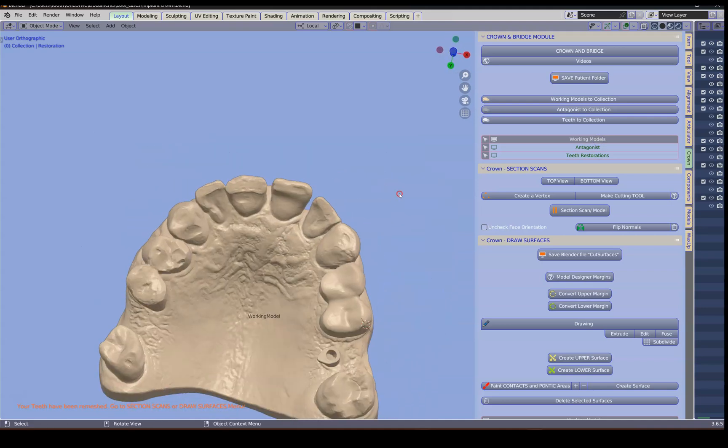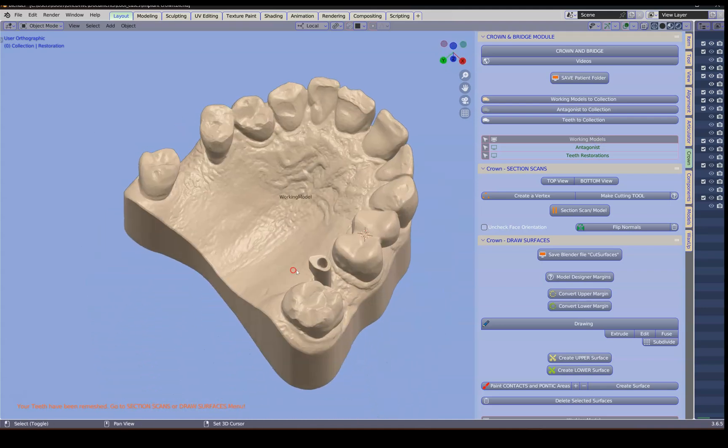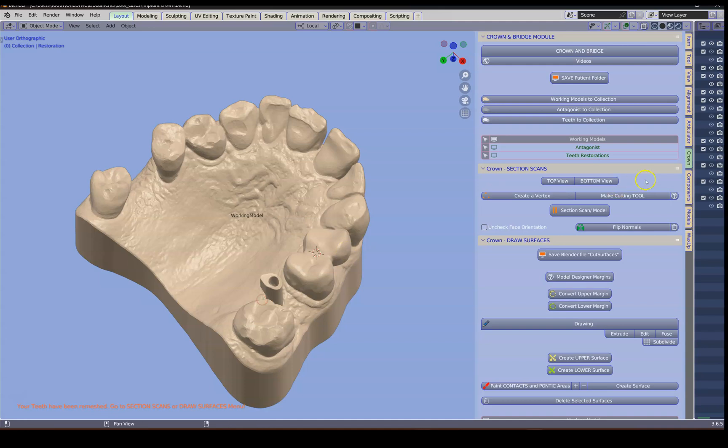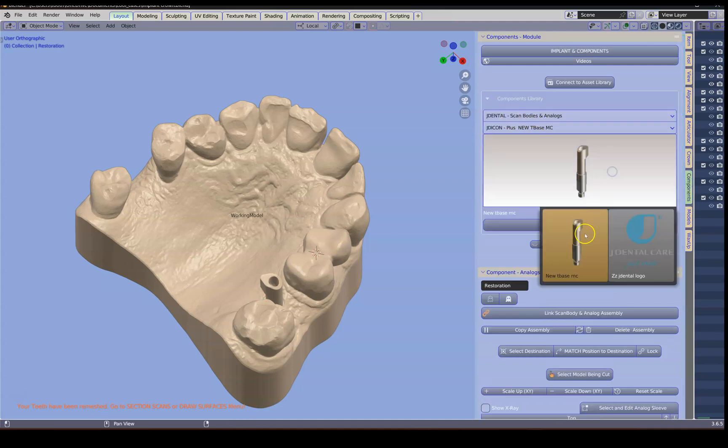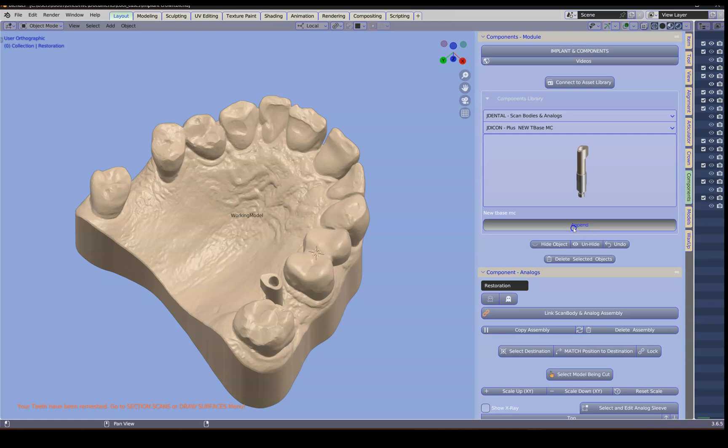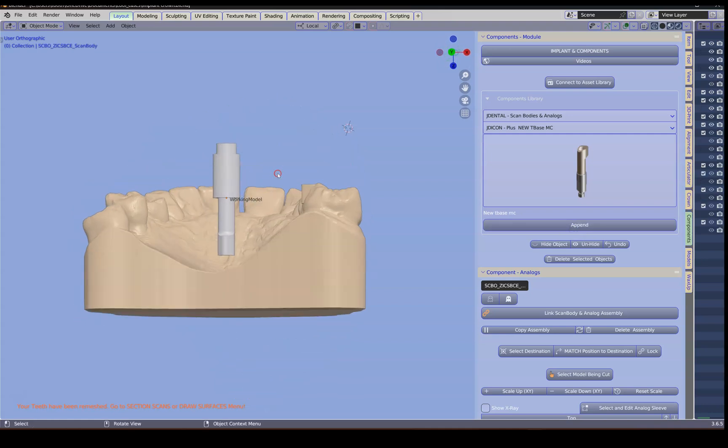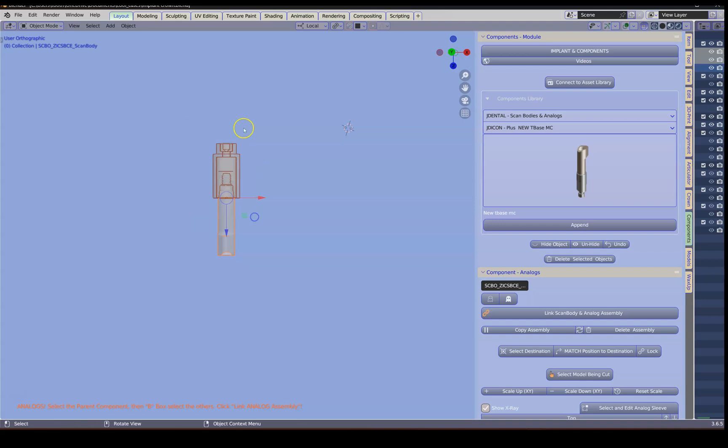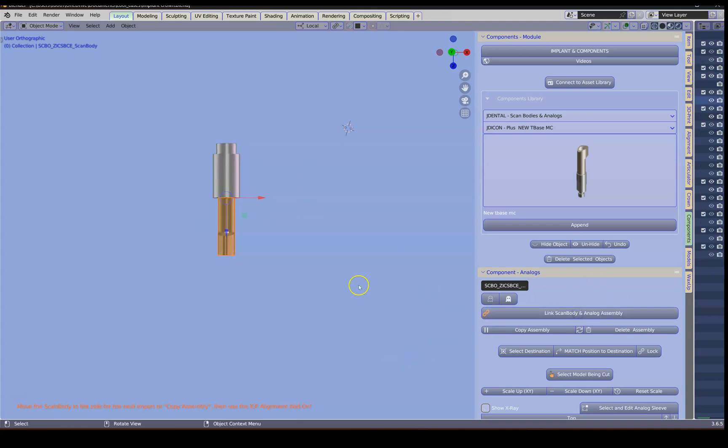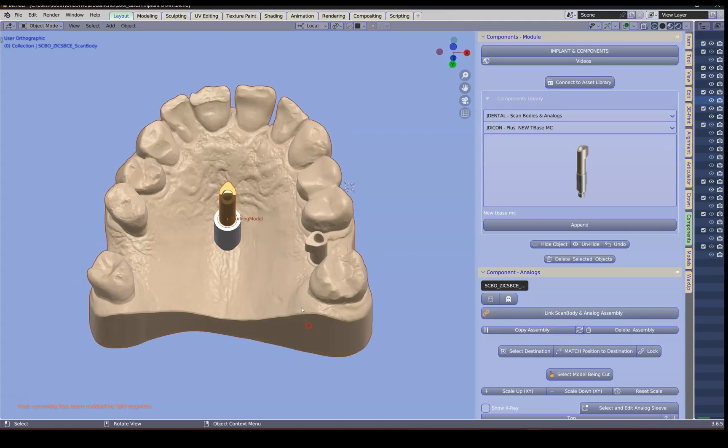Next what we want to do is we want to get a part over there. So we're going to go to the components module. This is a J Dental and we're going to select that one which comes into the middle. I'm briefly going to hide this one. In transparent mode we're going to select that and using the B key for box select we're going to link that scan body up and we're going to rotate it.